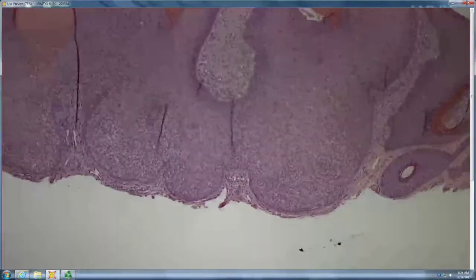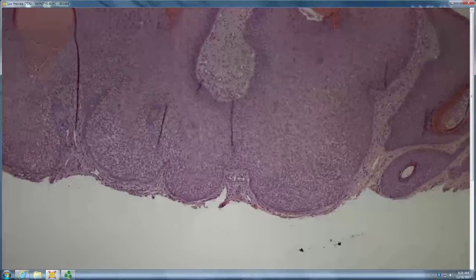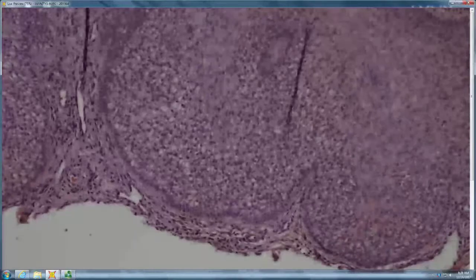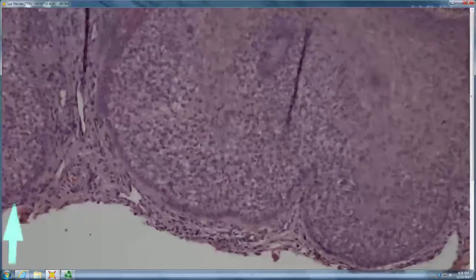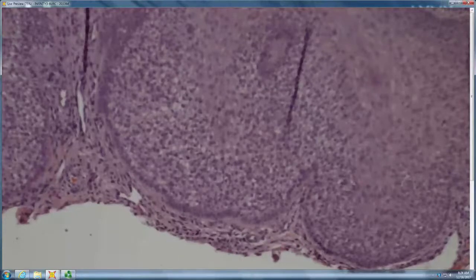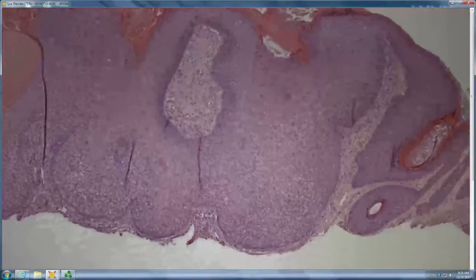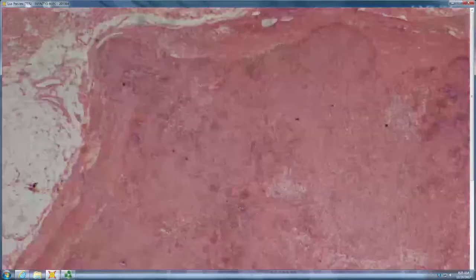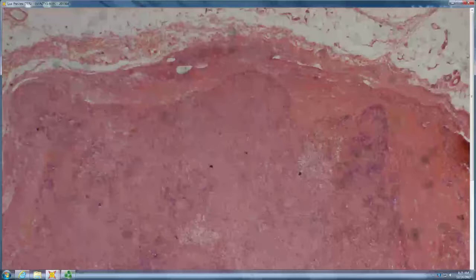This looks like it could be Bowen's disease. It's got a peripheral palisade and a little bit of a thicker basement membrane zone. Trichilemmoma. We call it that because they're tricky. Right? So the trichilemmoma, outer root sheath differentiation and a little warty papule.